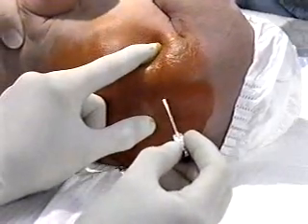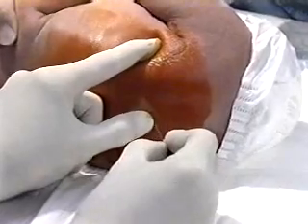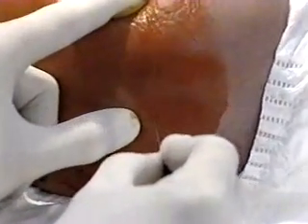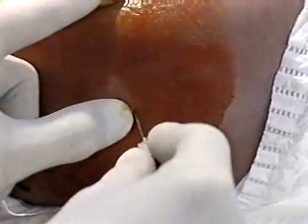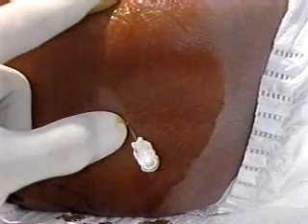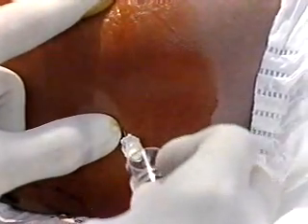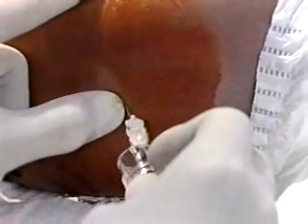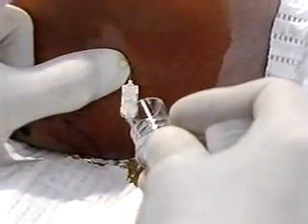The practitioner picks up the spinal needle, and while still holding the insertion site with one finger, inserts the spinal needle into the interspace. The needle is aimed slightly cephalad or towards the umbilicus, with the bevel of the needle directed toward the head. The needle should be advanced 0.5 to 1.5 centimeters, depending on the size of the baby, until CSF is obtained.